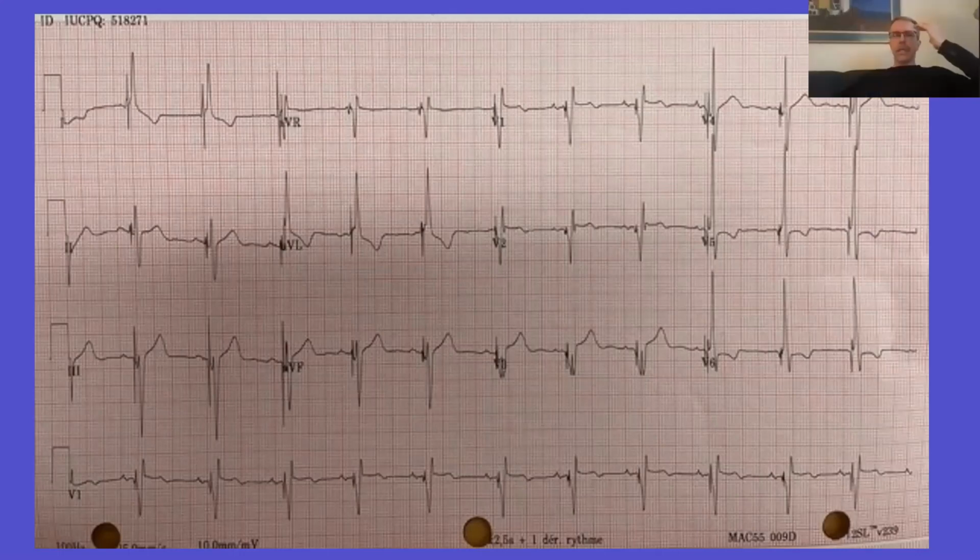I was going to say it looks like very distal His pacing. How you separate these out becomes somewhat difficult. The other thing I've seen is a couple of times, 2 times, I've screwed deep. I did septograms on these, and I did get His bundle pacing, clearly His bundle pacing, unequivocally. In 2 cases I'm 10 millimeters into the septum, so I assume there's the occasional case. I don't ablate AV nodes, but I guess every once in a blue moon you have to go from the left side.